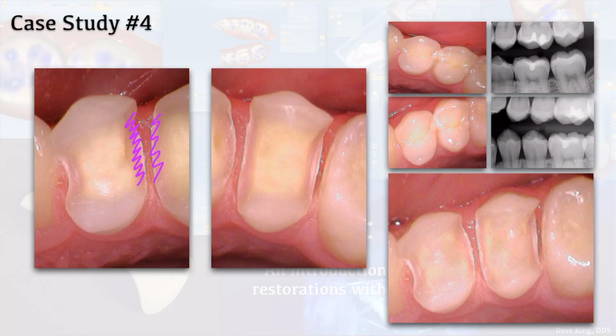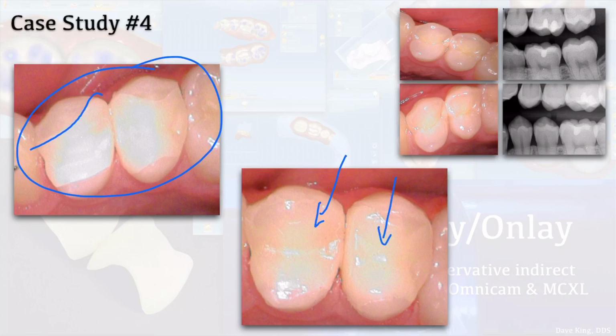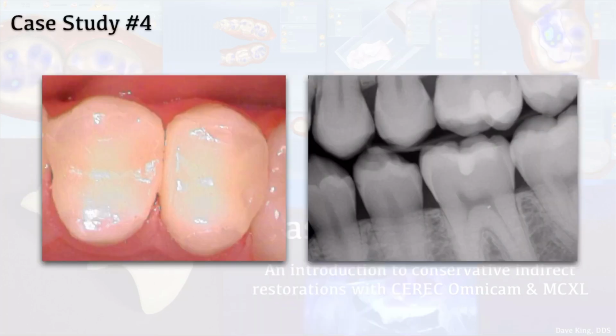So there's the preps compared to the pre-op picture, and there's the pre-seat, the evaluation looking at the seat and the fit. Turned out beautiful. They seat just nice. They're not polished yet. And then here's the delivery. One minor concern for you, this was smoothed off a little bit. We have just a little microscopic marginal mismatch there, and you can see the margin in that area. But in the end, they looked great. I didn't quite recreate all the tertiary anatomy and all the grooves that are in there. But in the end, it turned out just great. So, good case for you.